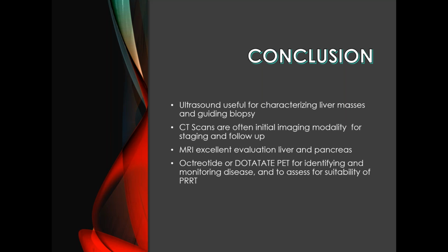This individual says, after having a gallium-68 scan, there is an avid neuroendocrine tumor confirmed in the pancreas. It seems to show at 1.3 centimeters. It's smaller on the PET scan than it was indicated on the MRI at 1.8 centimeters. The MRI also shows another one without indicating the size that the PET scan says might be too small. So let me just get to the question here. The difference between the sizes could mean the difference between needing surgery right away or not. My surgeon wants to wait and do another MRI in June. What would you recommend for someone in this scenario?